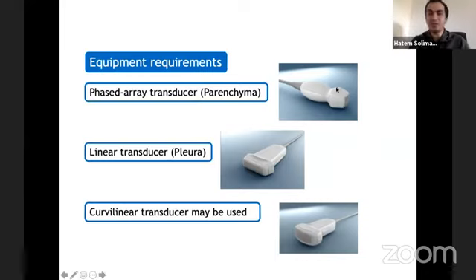The cardiac probe can be used as well. And some people were asking whether we can use it. Yes, we can use it. I mean, it gives you less depth than the curvilinear probe, but it is a good probe to be utilized, especially as part of your echocardiography study, as an extension of your echocardiography examination, and it has a smaller footprint, so it fits easily in the intercostal space.